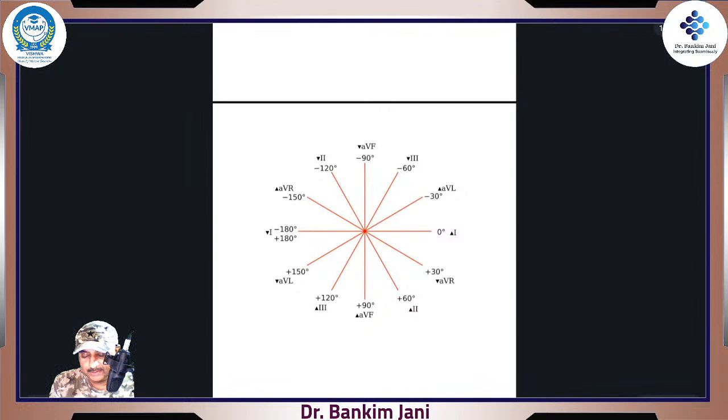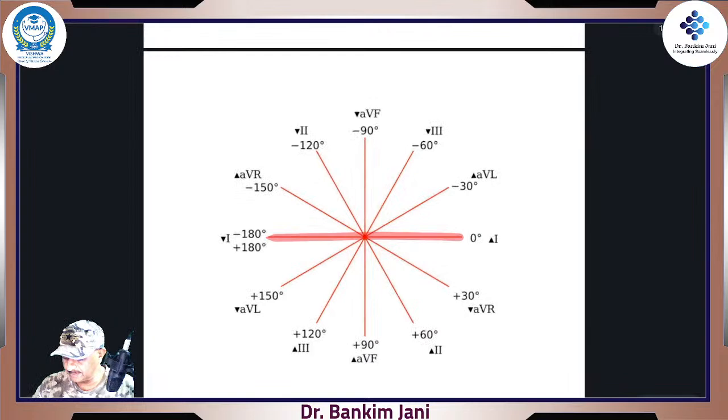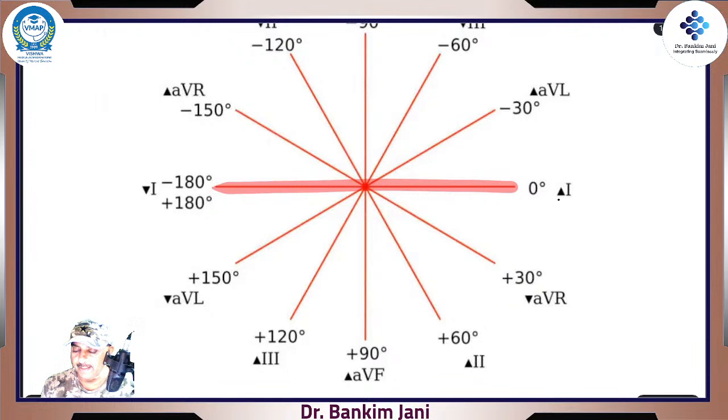Right, so watch, I'll just zoom this thing. This is 1, right? It is showing up, that means this side is plus. So practically you are watching it from here, right? This is 2. So you are watching it from here. This is 3, right? This is also up. So you are watching it from here. This is plus, right? Electrode wise, I'm telling, they are plus.